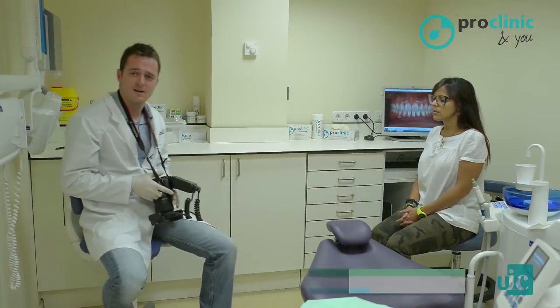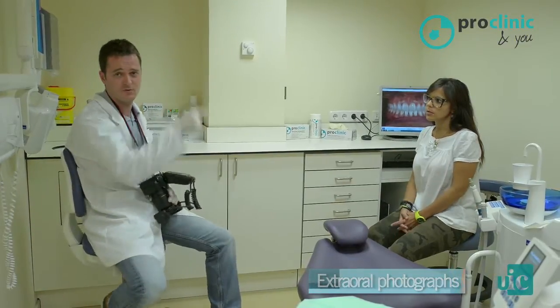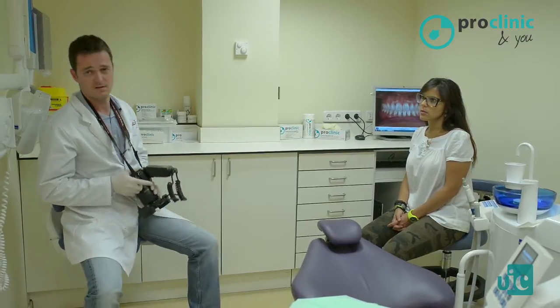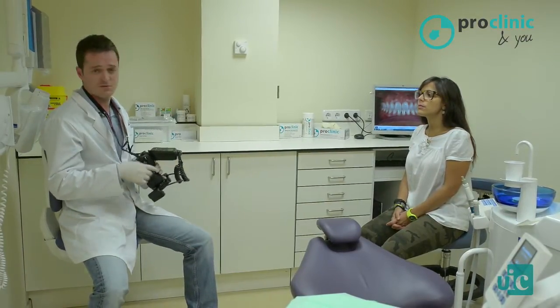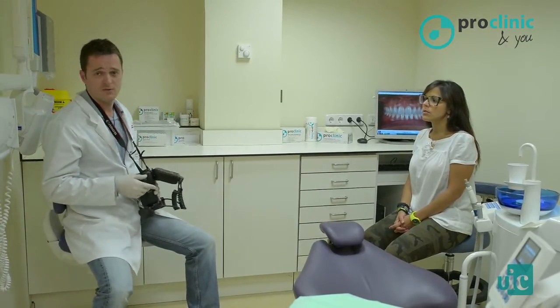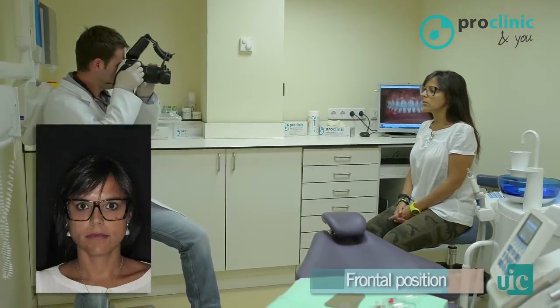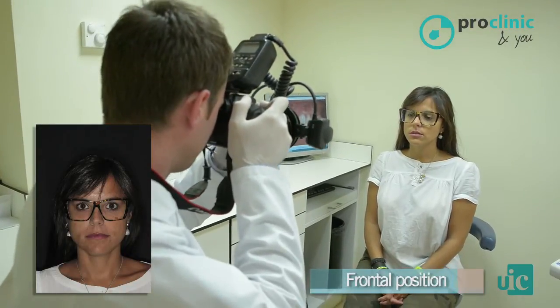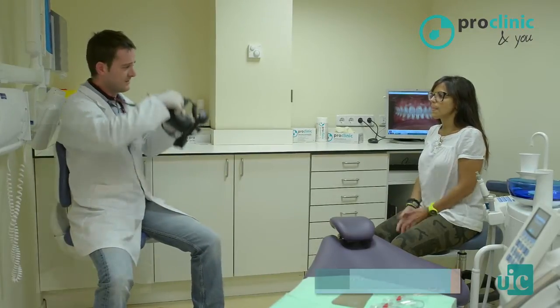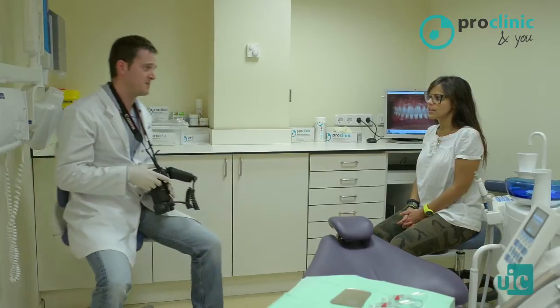To obtain the extraoral photographic sequence, we need to place the patient in front of a uniform background and then start the sequence. First, we will take full-face extraoral photographs. Photo of the frontal position of the face. Frontal photograph of the patient smiling. Photos from both sides, right and left.